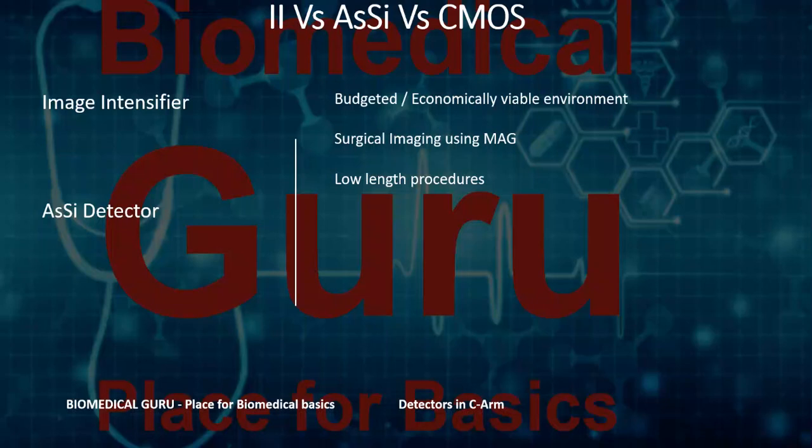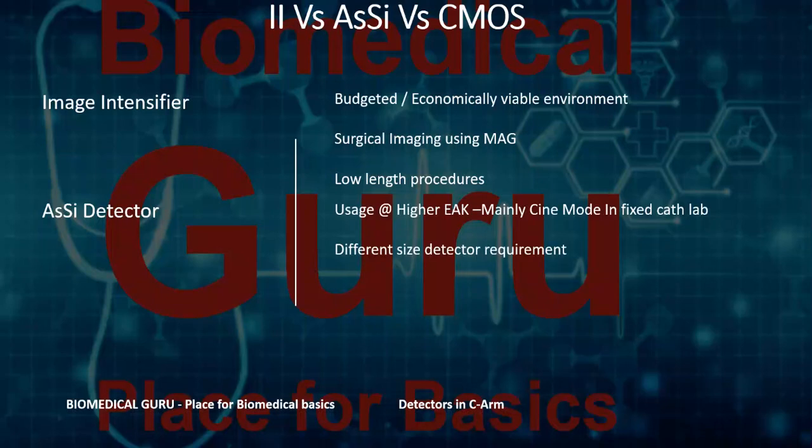And then where do we need to go for an amorphous silicon detector? Amorphous silicon detector is typically for high EAK, which means when you want to use more of a high dose procedure, typically for a fixed cath lab where the generator is typically 100 kilowatt and output is typically 500 mA, then amorphous silicon detector works very efficiently. And also when you have a different size requirement, typically in an oncology environment where they want the detector to be much bigger than a surgical or vascular environment.